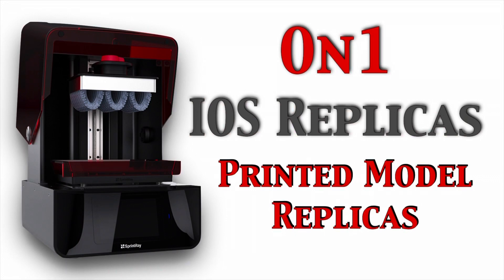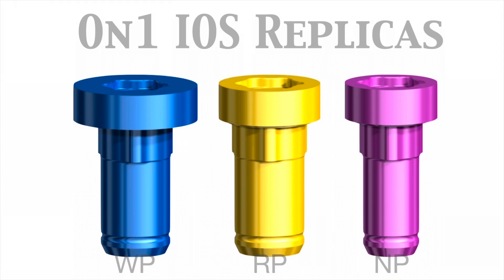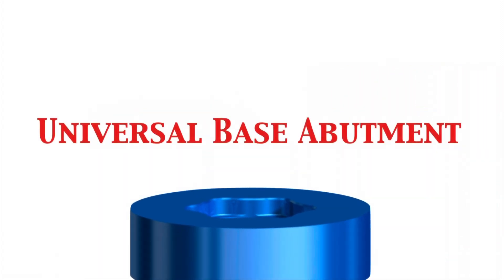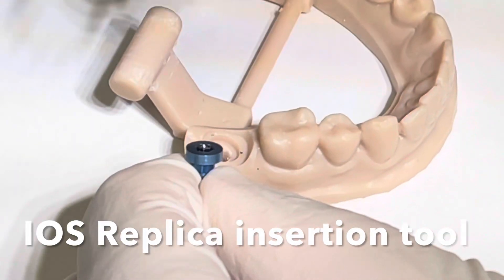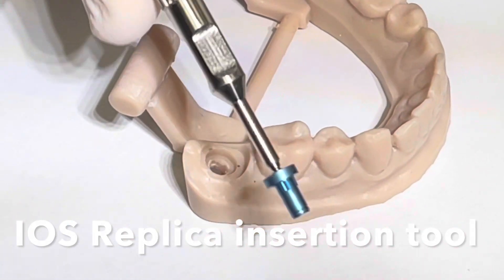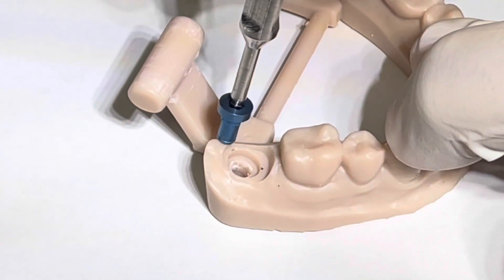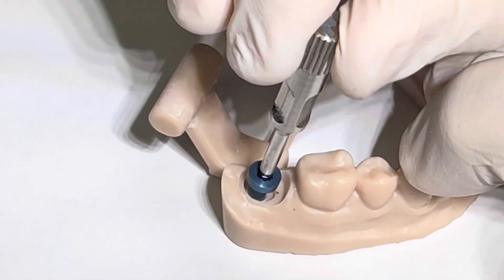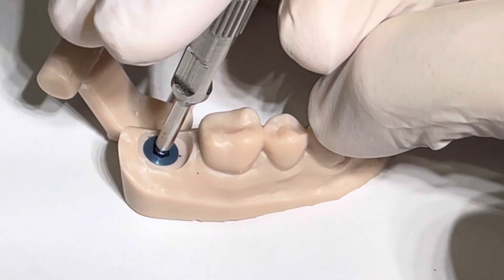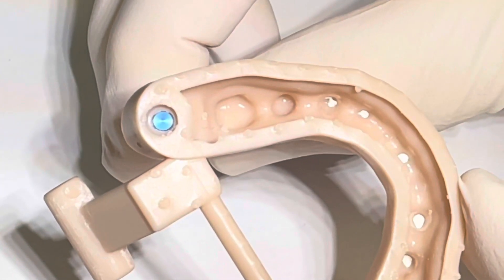Let's look at the on1 intraoral scan replicas. These are used for printed models to represent the platform of the on1 abutment — not the implant itself, but the abutment, since the abutment has been placed and we're taking an impression of that. You use the intraoral scan and then take this replica and use the insertion tool to place it into the model. The model has been printed with a seating point — a tri-oval area — and it seats down until it's flat with the internal aspect of the printed model.